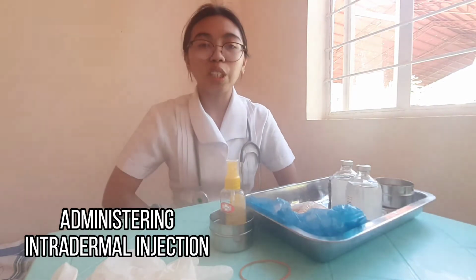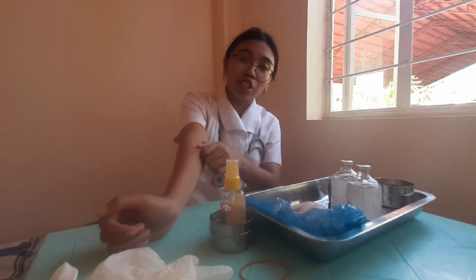Everyone. So for this video, we are going to administer the intradermal injection for our patient. So for the intradermal injection, asa na siya dapit? So dirira na siya sa skin, which is 10 to 15 degree of angle ang atong pagkuan niya. 10 degree angle. So for this we have here the assessment.